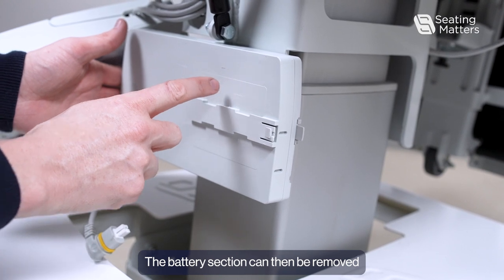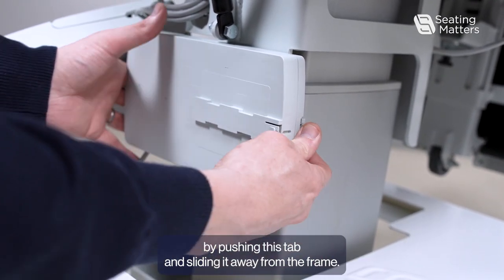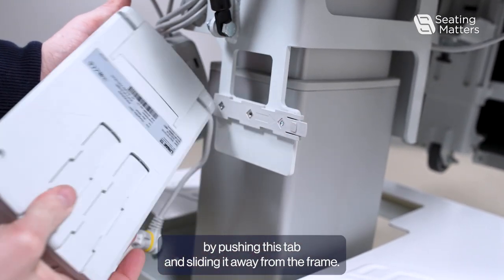The battery section can then be removed by pushing this tab and sliding it away from the frame.